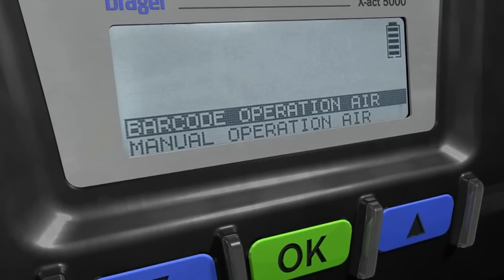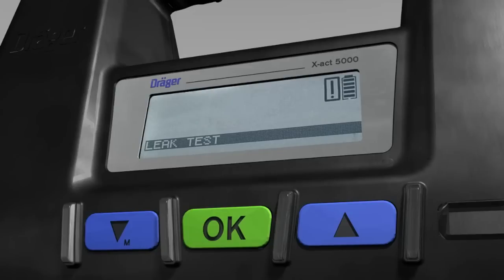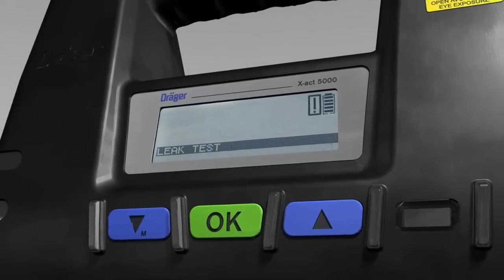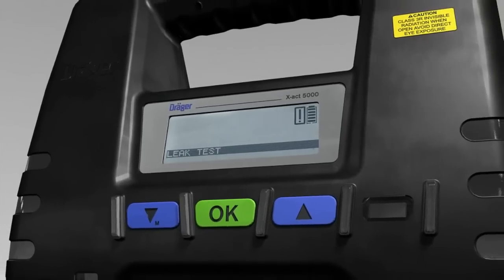In this case, a leak test will always have to be carried out once the chosen interval has expired. The warning icon will appear in the display and no measurement can be carried out until a leak test has been conducted.